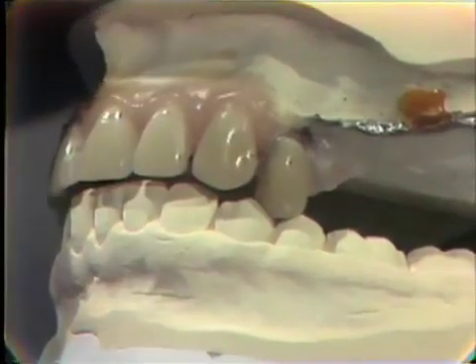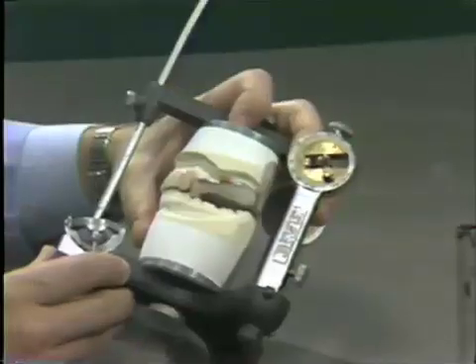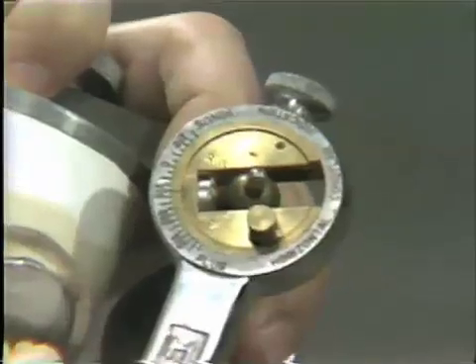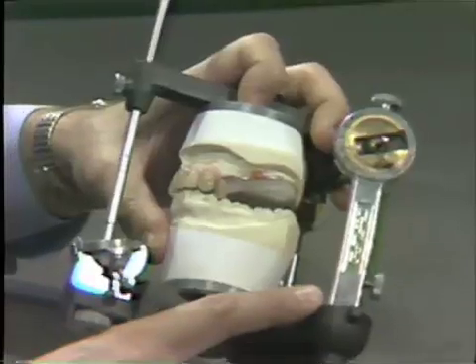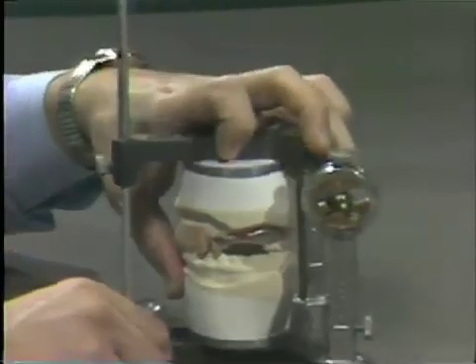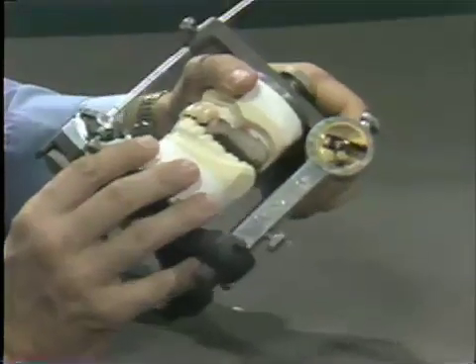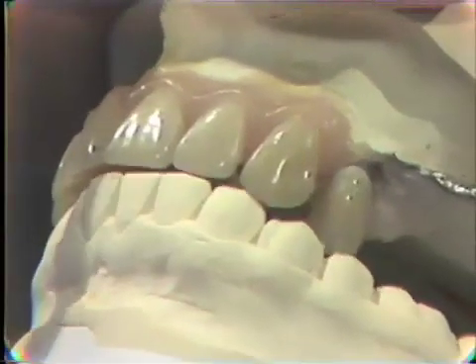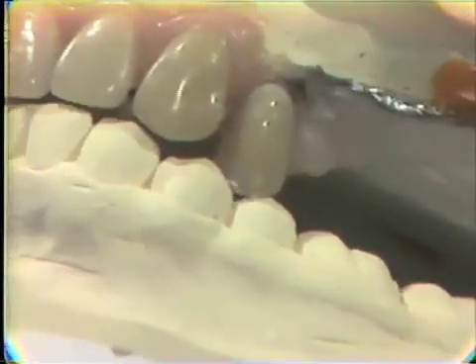The other requirements involve the articulator settings derived from our patient. The condylar elements for this exercise are set at 20 degrees bilaterally, the Bennett angle at 15 degrees, and the incisal guidance on the incisal table at 20 degrees. After the tooth has been set properly, the condylar elements are freed and the articulator is allowed to move so that the teeth can pass over each other. We can see a very heavy buccal contact, which is our working contact, and that needs to be reduced.